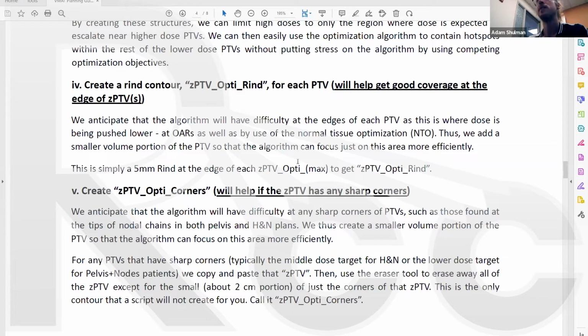Yep, good question. So to the first question, who draws the organs at risk? That would depend on your clinic. Typically this comes down to expertise and workload. Lots of centers, I think, the dosimetrists end up contouring all the organs at risk and the doctors will review them. But I've seen centers where the doctors contour everything. You don't have to worry about anything. It's a luxury as a physicist if you get that. Sometimes the physicist has to contour.